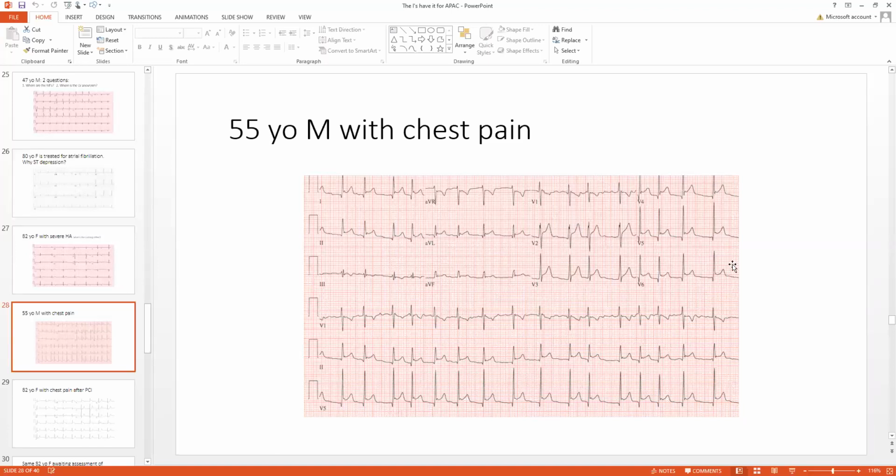But you can do one thing to help you with reading your electrocardiogram. You could take out a stethoscope if this were your patient, and put the diaphragm on the chest, turn the patient to the left, ask the patient to take a breath if he could, and you'll hear a pericardial rub.